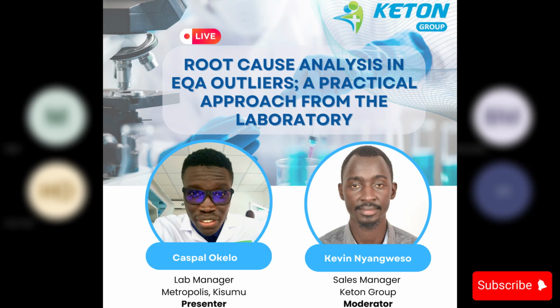Then in the medium term, maybe in the next EQA sample, after 1 month or after 3 months. Then in the long term, after 2 or 3 EQA cycles or 3 to 6 months, do you have a stable QC? So at least 1 full EQA cycle would show you if whatever you implemented is working.